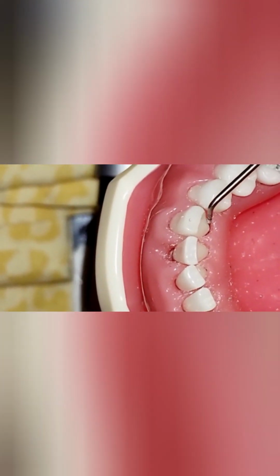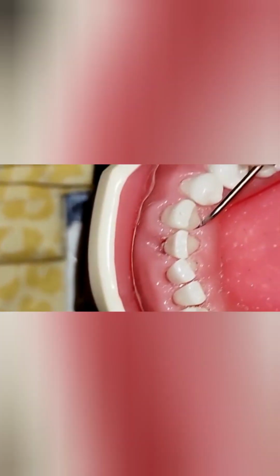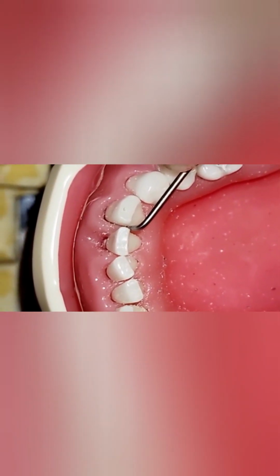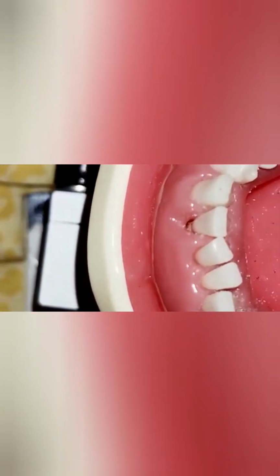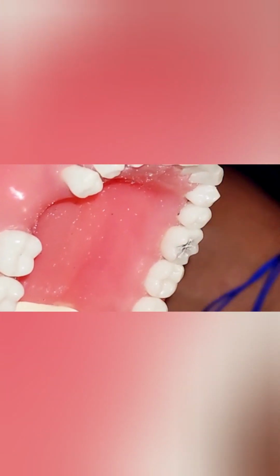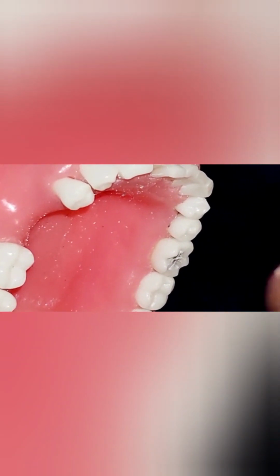9. 7, 8. Now we're coming over to our posterior teeth. We will need a mirror for this. Okay.